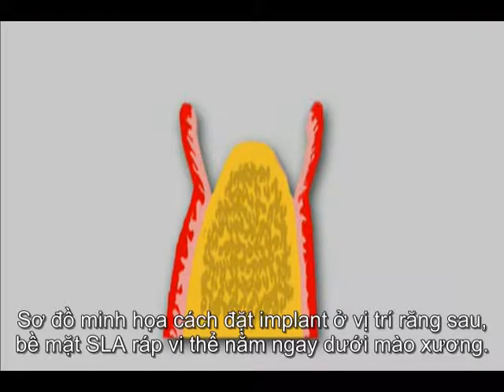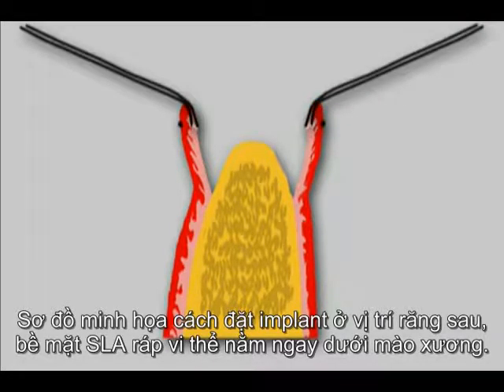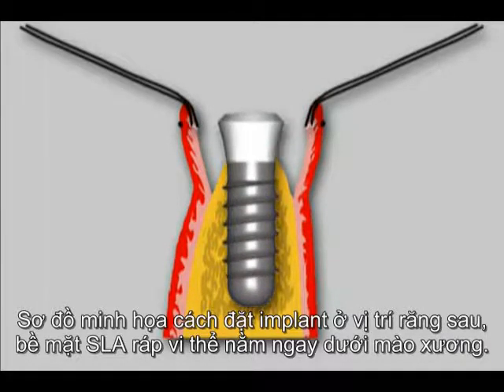The diagram illustrates how implants are placed in posterior sites. The micro-rough SLA surface is located just under the bone crest.